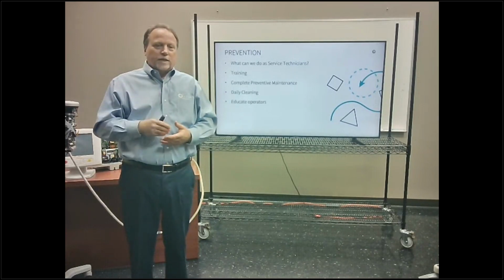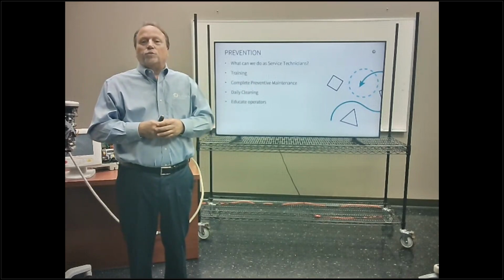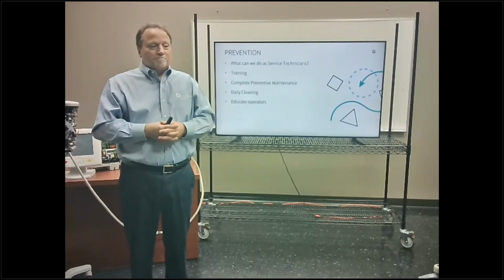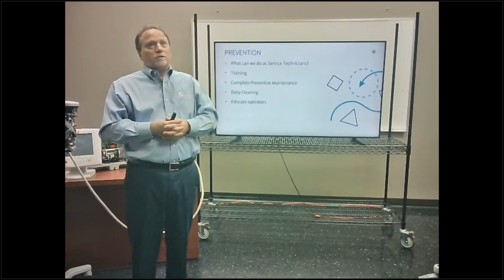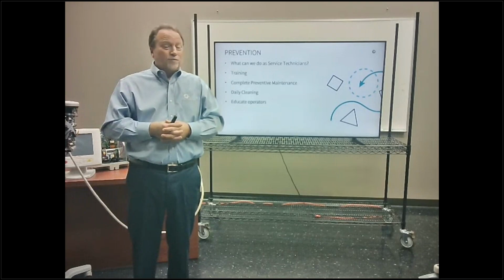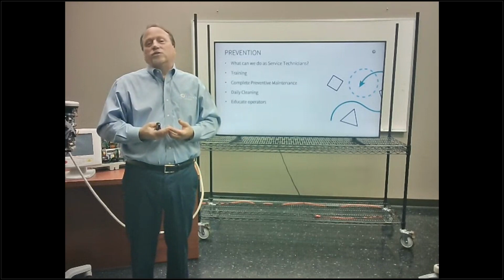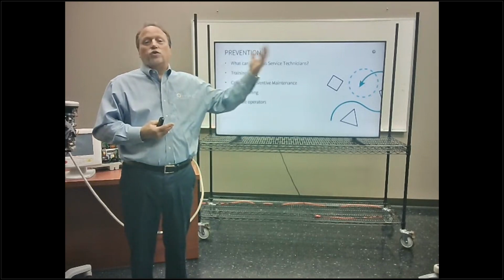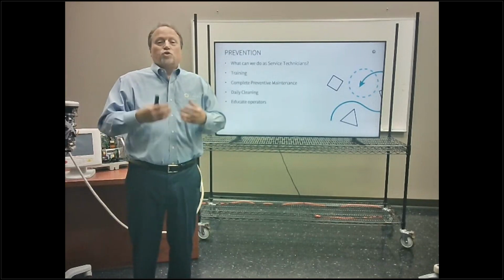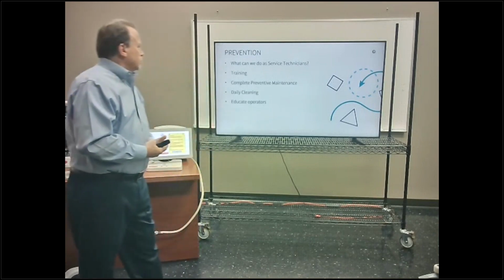Here in the Tennessee area, I started a couple of years ago with Althea, and I started doing PMs on some of the sites here for Althea, and our service calls went down to like a handful a year, when they used to be a handful a month, only because of good cleaning and good preventive maintenance. There's some injectors I haven't seen all year long, and we're doing PMs the next month or two. Haven't seen them. Good preventive maintenance will decrease your service calls.